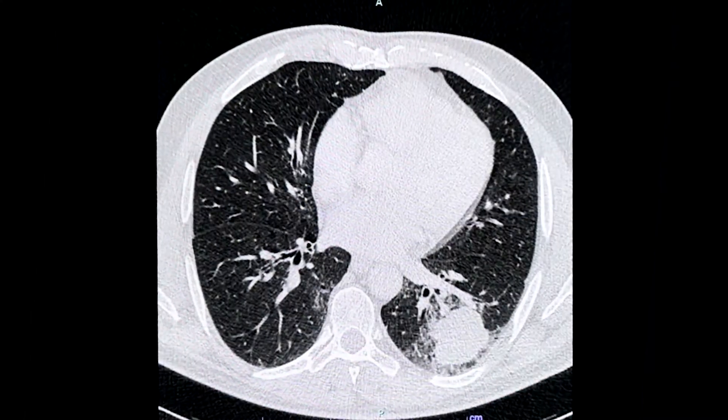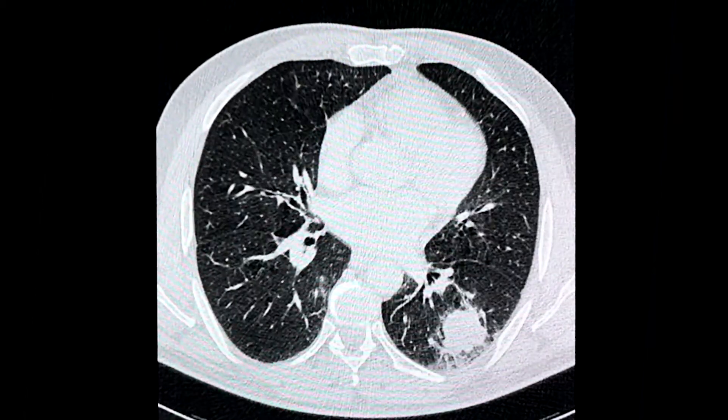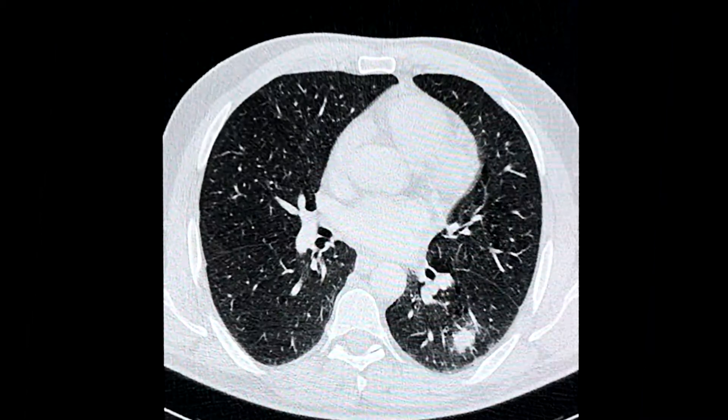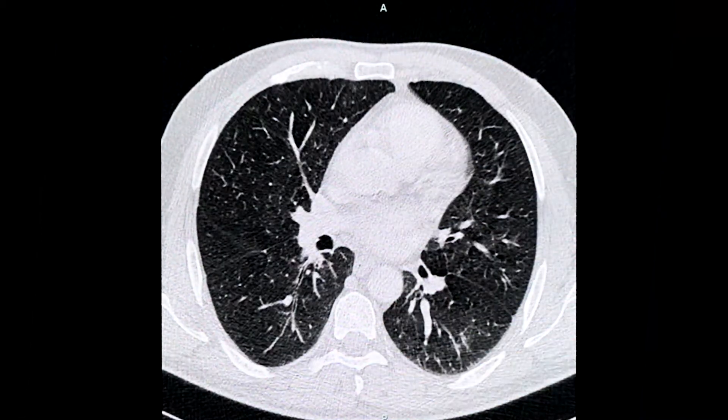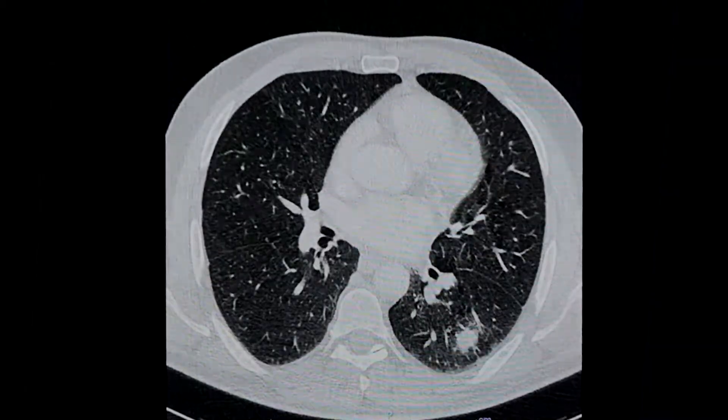Professor Hart demonstrates his approach to nodule biopsy using the flexible, single-use, 1.1 mm cryoprobe on a patient with a solid lesion in the left lower lobe, which is suspected of malignancy.